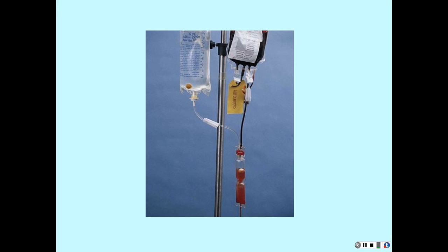You're going to open this one and squeeze the chamber, and it primes down to the chamber. When the blood starts to come down this way, it will prime it, and you've got enough space in here that you're not going to put air down in your drip chamber.